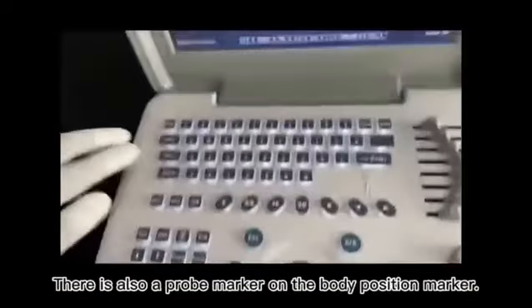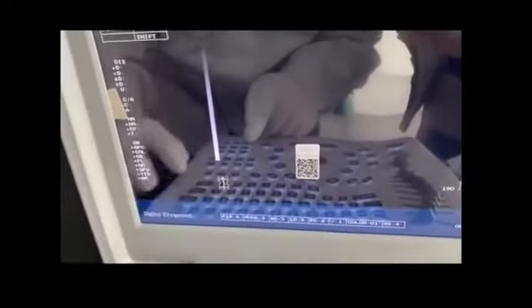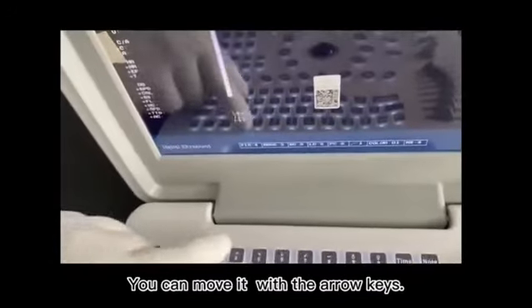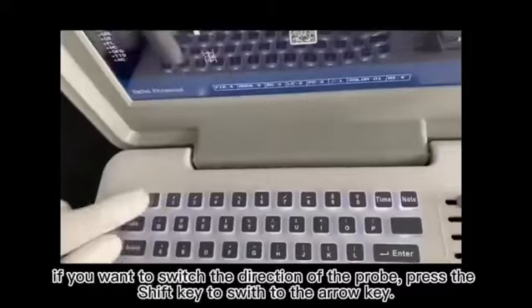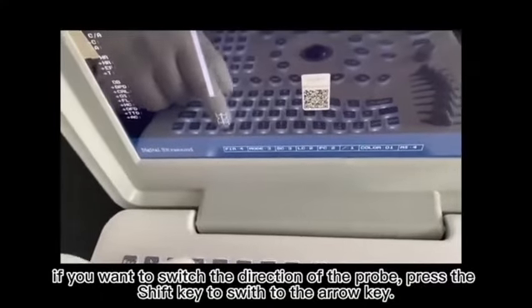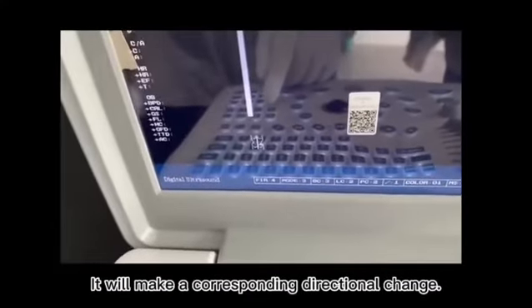There is also a probe marker on the body position marker. You can move it with the arrow keys. If you want to switch the direction of the probe, press the Shift key to switch to the arrow key. It will make a corresponding directional change.